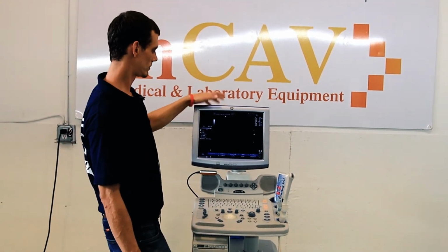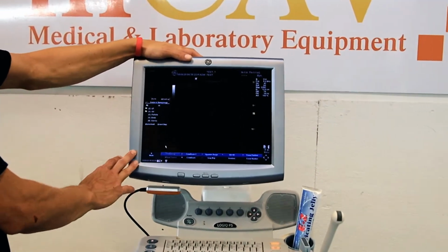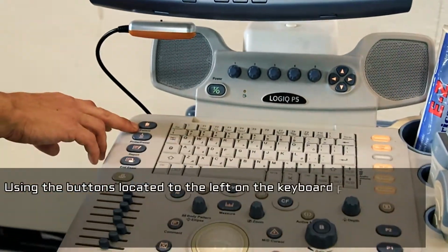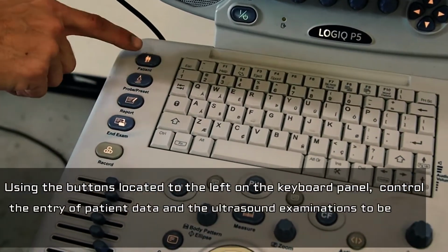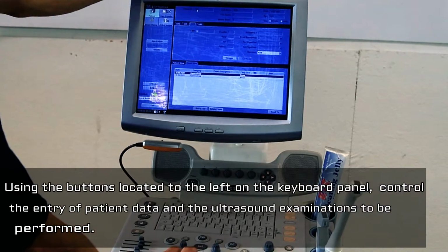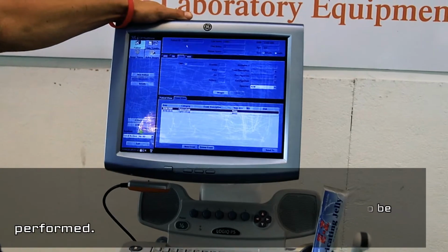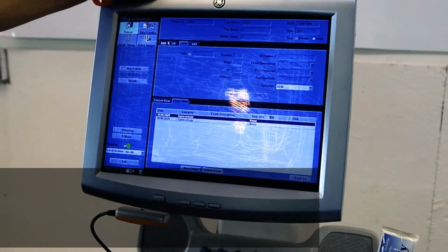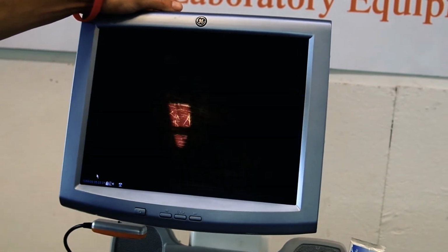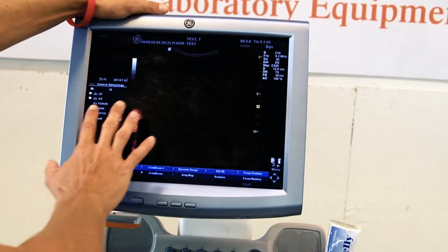Once you have loaded up successfully, this will be your primary screen here. This is where you'll actually start all of your procedures. If you look at the controls here, you'll have your patient readout. All you do is hit your patient. You'll fill in all of the areas here: your patient ID, last name, first name, date of birth, male or female. We already have one set up for this particular instance, so we're just going to go with that. We'll come down here once we've got it selected and exit.